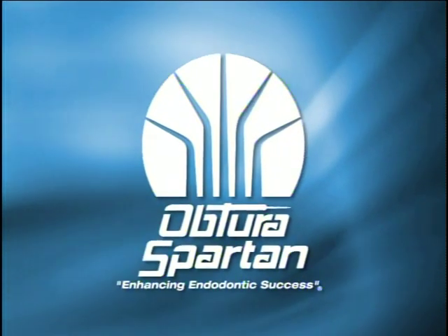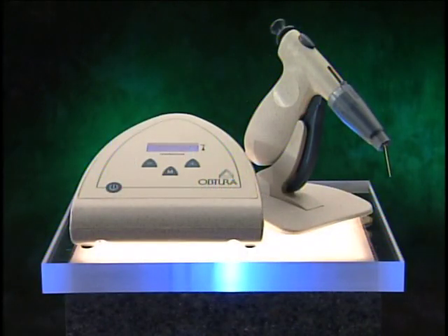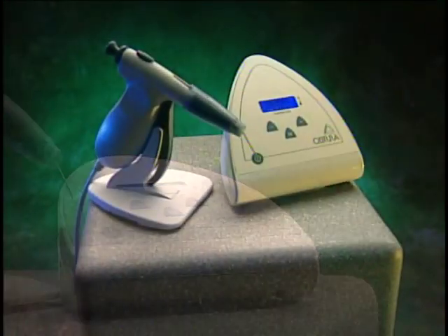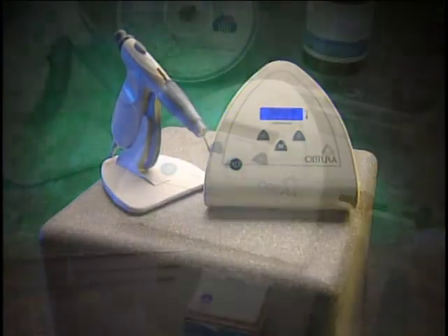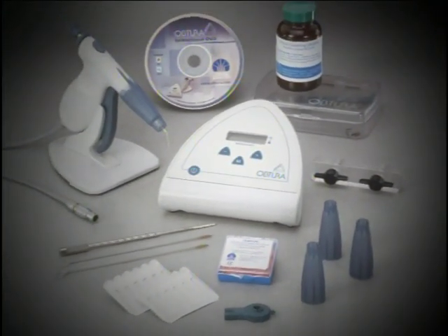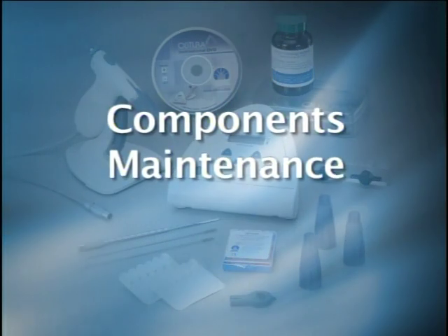Congratulations on your purchase of the Obtura heated gutta percha obturation system. First developed by a group of dentists in the late 1970s and available to dental practices since the early 1980s, this newest generation of Obtura promises to improve your productivity and deliver superior quality healthcare. The first step in achieving optimum proficiency is becoming familiar with the Obtura system's components, maintenance, and operation.